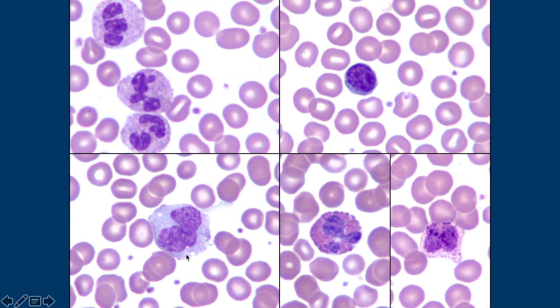This big cell is a monocyte. It has more of a blue-gray cytoplasm, and the nucleus can be variably shaped. Sometimes the nucleus looks very much band-shaped, which can cause confusion. Make sure you look at your cytoplasm — it can be very helpful. A band is technically an immature or left-shifted neutrophil.